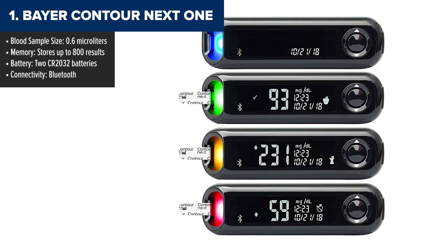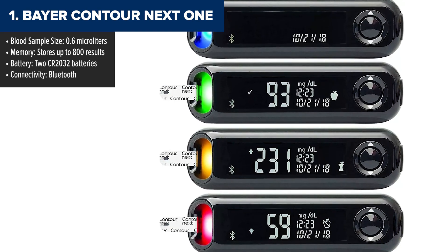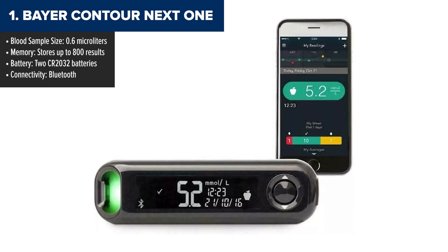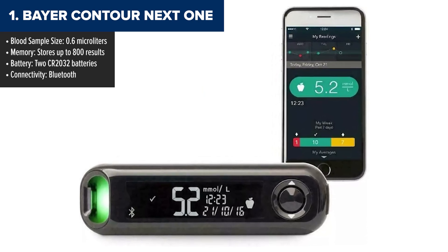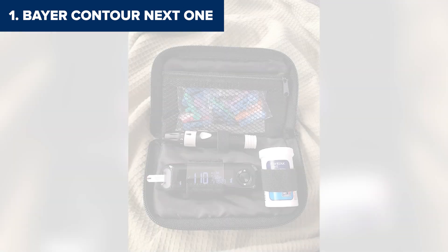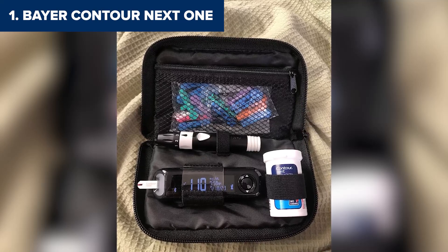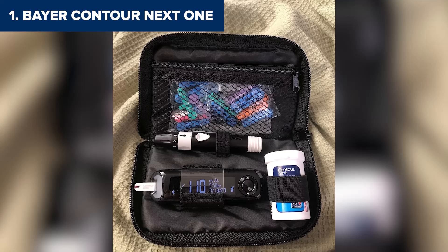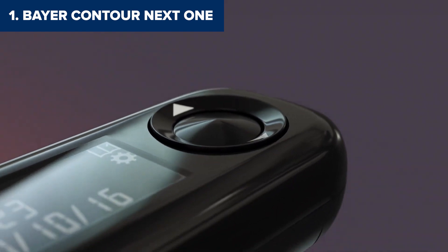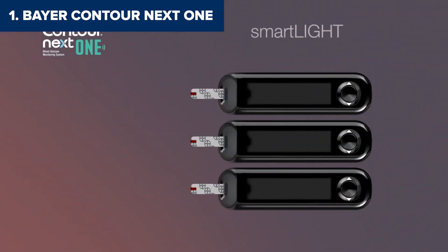Finally, the gold medal goes to the Bayer Contour Next One. This monitor is an absolute powerhouse, offering a winning combination of accuracy, user-friendly features, and smart technology. The smart light feature provides instant feedback by lighting up in green, yellow, or red to show if your glucose is within range, slightly off, or far off. It also has second-chance sampling, which lets you reapply blood to the same strip if the first drop wasn't enough, saving you from wasting strips or enduring additional finger pricks. Add in Bluetooth connectivity, and you can easily sync your readings with the Contour Diabetes app for detailed tracking and analysis.